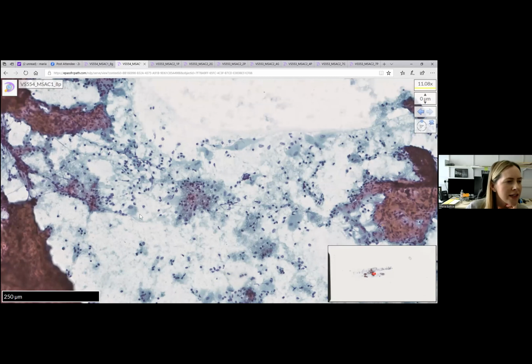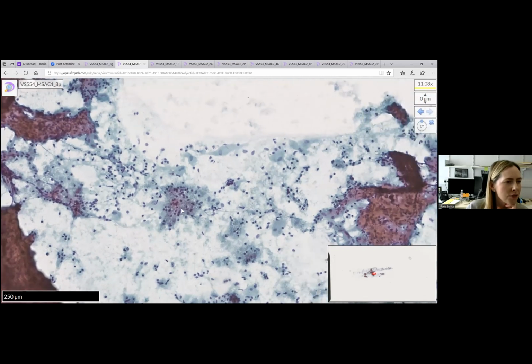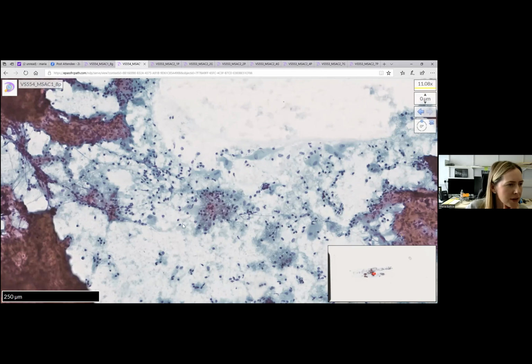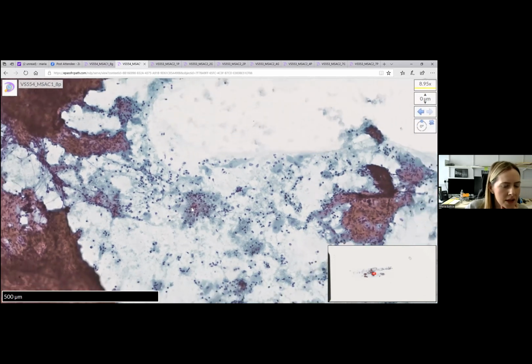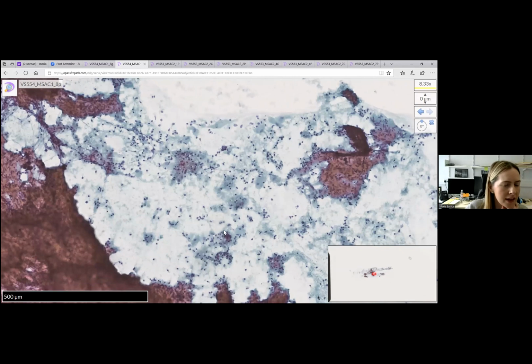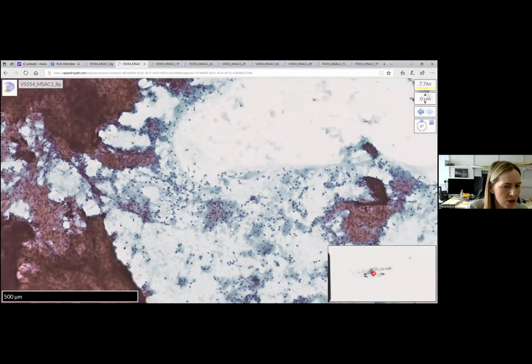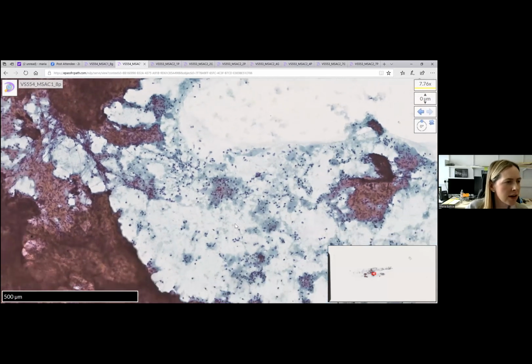Yes, and thank you for already giving me your diagnoses. So yes, you have correctly identified granulomatous inflammation. I've shown these nice clusters of histiocytes forming granulomas, and they can be either epithelioid or more spindle shaped. I showed an example where the nuclei are sort of kidney shaped and they're loosely aggregated on a background of lymphocytes. I think the important pertinent negative here to write in the exam is that there is no background necrosis, because then that guides your differential. So calling this non-necrotizing granulomatous inflammation is the correct answer.